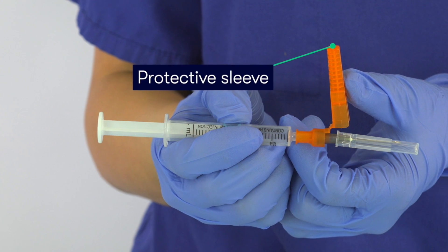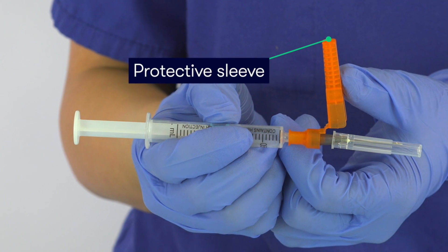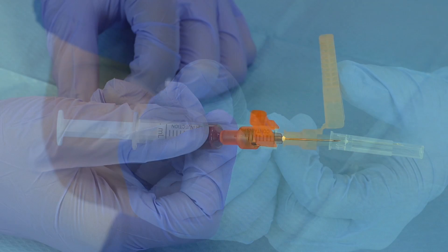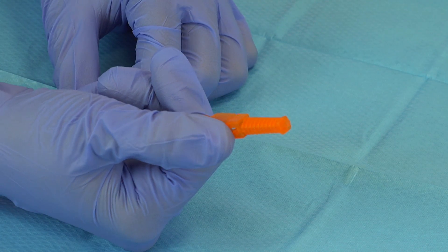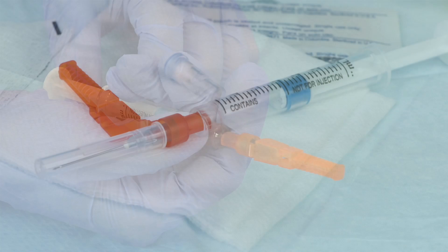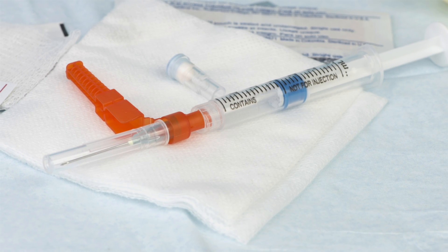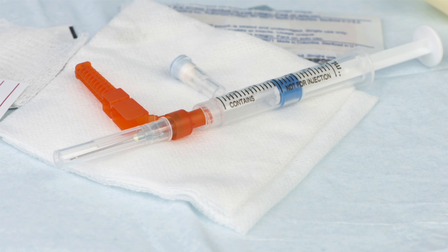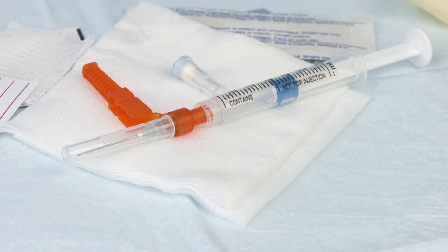The needle that we are using has a protective sleeve, which can be placed over the needle once the sample has been obtained. So this allows it to be removed and disposed of safely without the risk of any needle stick injuries. The syringe that we are using here contains heparin, which prevents the sample from clotting. However, some kits may require the needle to be flushed with heparin before use.